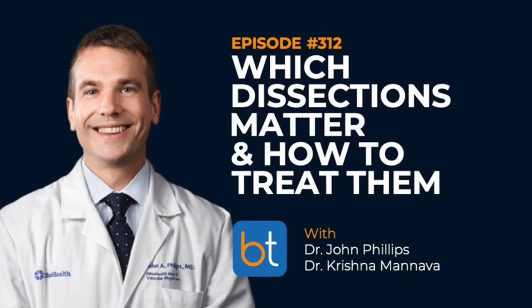Because I think in their IFU, if there's 30% residual stenosis or plaque, you're not really supposed to use them. But I use them in plaque all the time. I avoid it in heavily calcified areas.